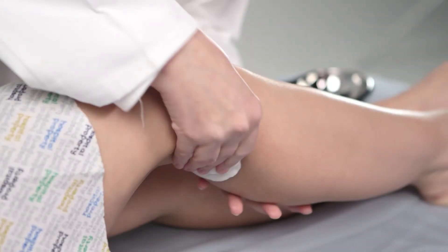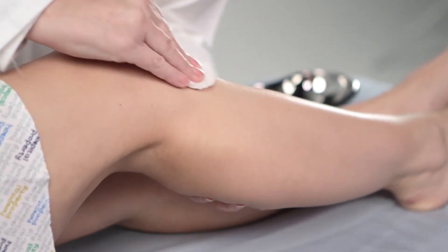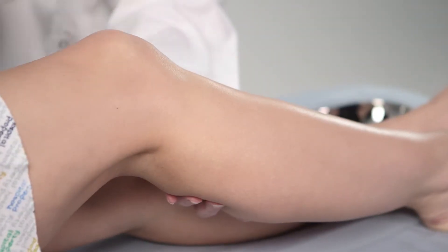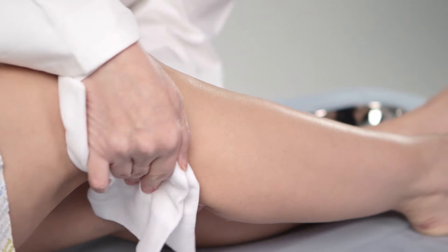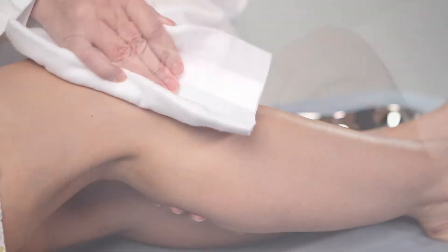Using warm water, wash the area where the device is to be fitted, removing moisturiser if present, and pat dry gently. For best results, using trimmers or clippers, remove any excess hair. Avoid shaving as this can damage the skin and increase the risk of irritation.